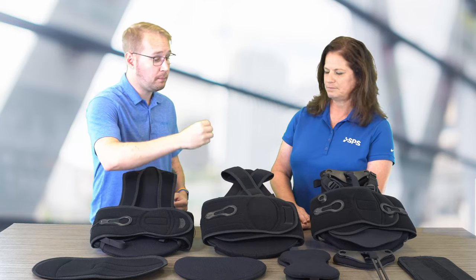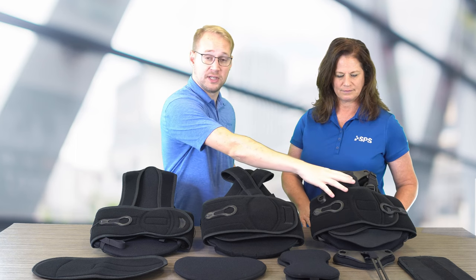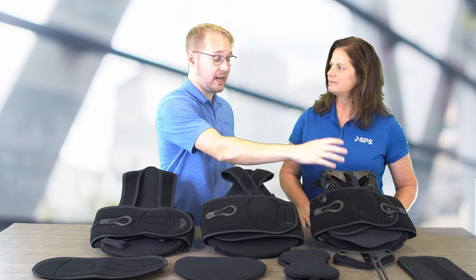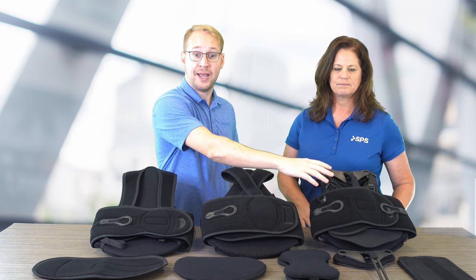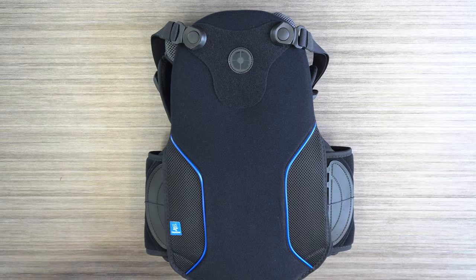For even more support and maximum level of control of the spine, you move up to the Sleek Max, which has that anterior sternal bar on it, and that is L0464. So Jack, in looking at the Max TLSO, point out some of the significant features here.